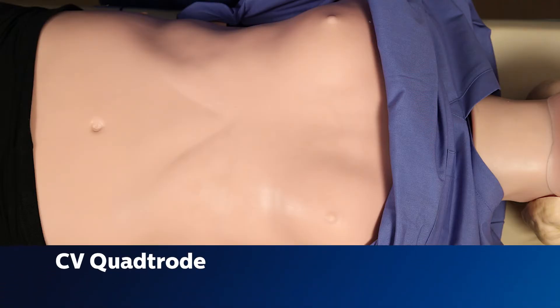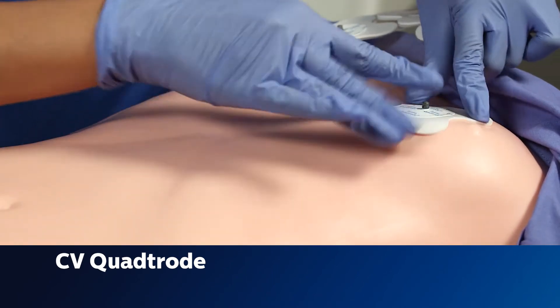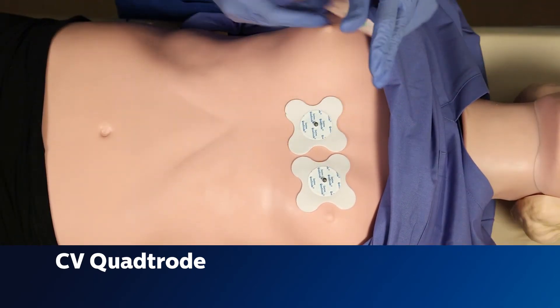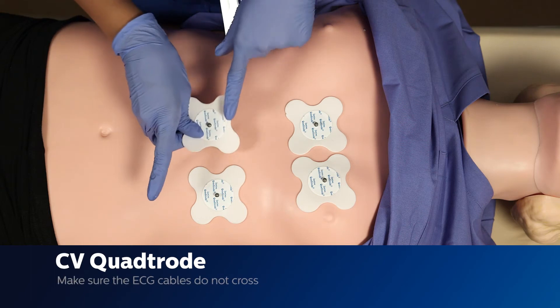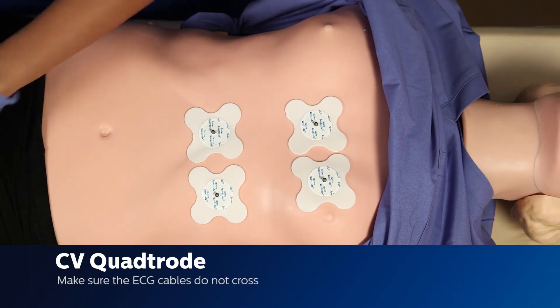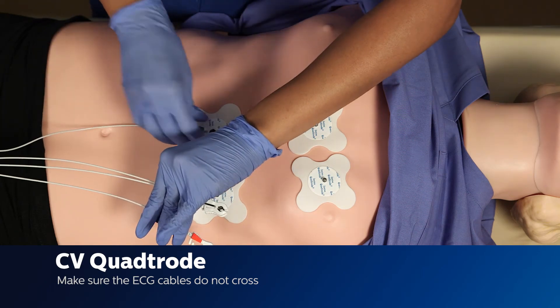When placing your quatrodes, go to the imaginary nipple line on the left side of the chest and place two in line with that side. Then place the other two on the lower half. All of them will be slightly to the left side — do not center them on the chest. If the patient has a large breast, the quatrodes go under the breast tissue, not over it.